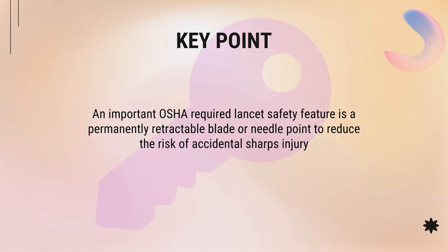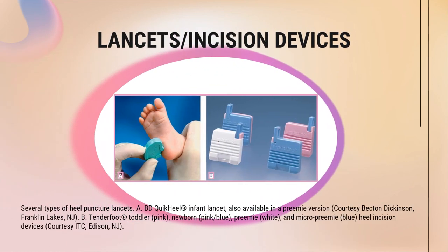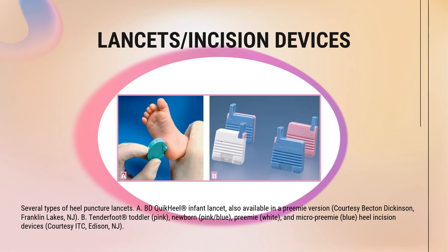An important OSHA required lancet safety feature is a permanently retractable blade or needle point to reduce the risk of accidental sharp injury. Here we have different examples of a lancet or an incision device. Then we also have a heel puncture lancet. We have the BD Quick Heel Infant Lancet and also the Tenderfoot Toddler Lancet.